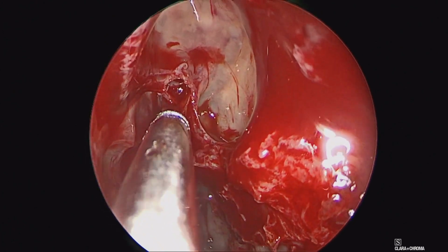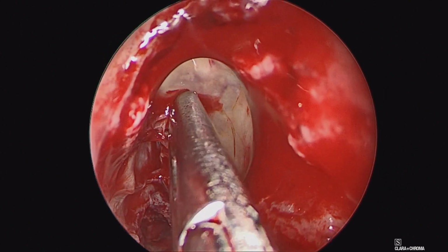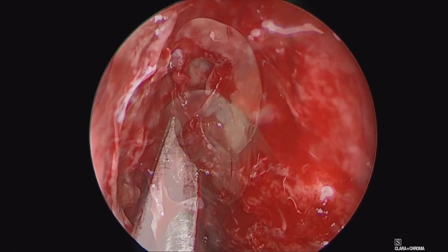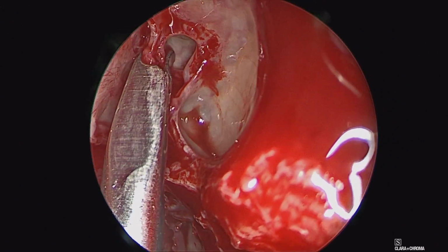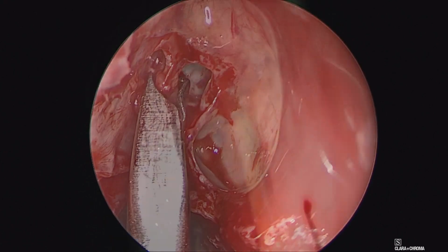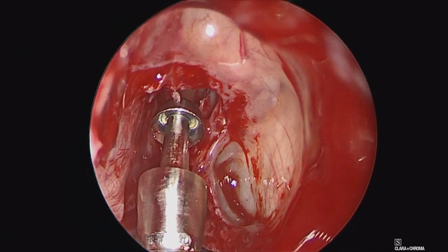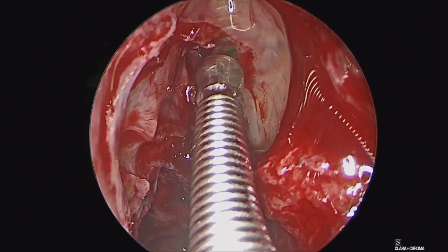In this case, the patient has a rather large supra agger frontal cell. So here we are working through the natural outflow tract of the frontal sinus just posterior to that. And here, the side-to-side frontal through-cutting instrument to take down that partition between the supra agger frontal cell and the natural outflow tract of the frontal sinus. And then here with a frontal Hosemann punch coming in and removing the remaining portion of that supra agger frontal cell partition to fully access and open up that frontal sinus.